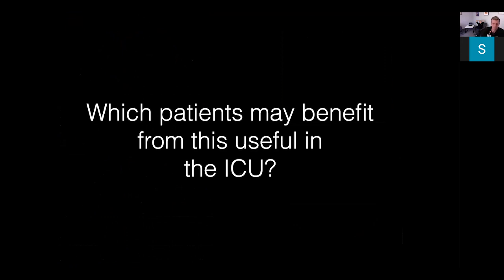Okay, so one of the problems that we've got in the critical care literature is I think we've got a lot of people who maybe didn't know how to do speckle tracking who started doing studies in it. And I'll put my hand up and say I probably am involved in that. I published some papers, I'll show them in a sec, using speckle tracking when I was learning it. I'm not entirely sure, looking back on it, that I was good enough at strain to do some of that when I did. I thought I was. I'd maybe done 50 images before I started doing that. That's probably okay. But we know that the more you do it, the better you get.